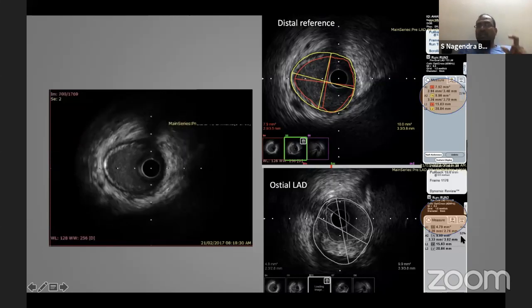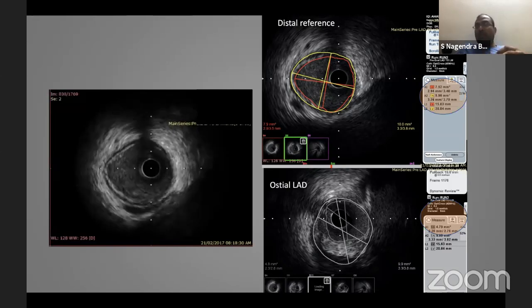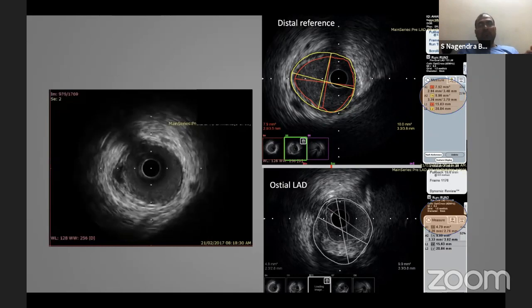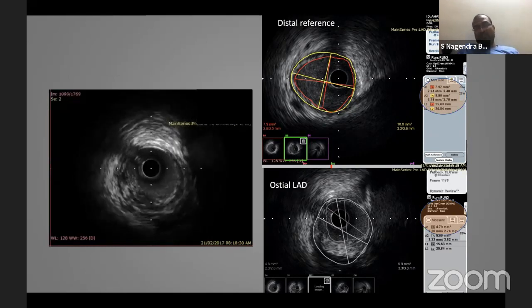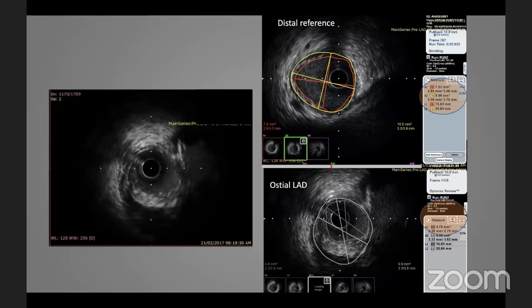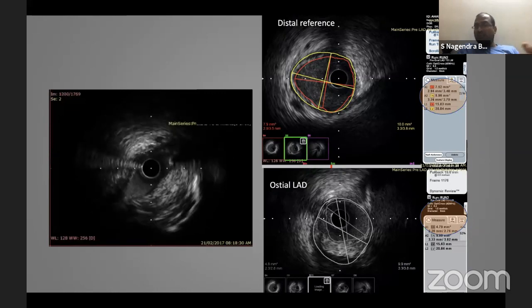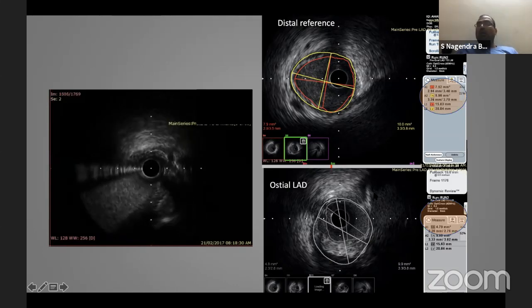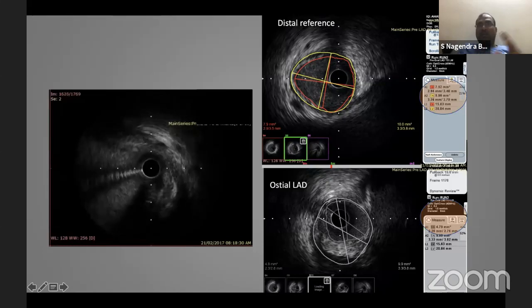This says that I cannot leave the stent from left main to circumflex. If the plaque burden in the ostial LAD is only 20 to 30%, one school of thought in dealing with a 101 lesion says that you can stent from left main into circumflex and decide about the left main LAD strategy later. But here the ostial LAD has a plaque burden of 52%. Actually, it's going to be more than 52%; it's underestimated here, more than 50%. It's not a 101 lesion. It's a 111 lesion.